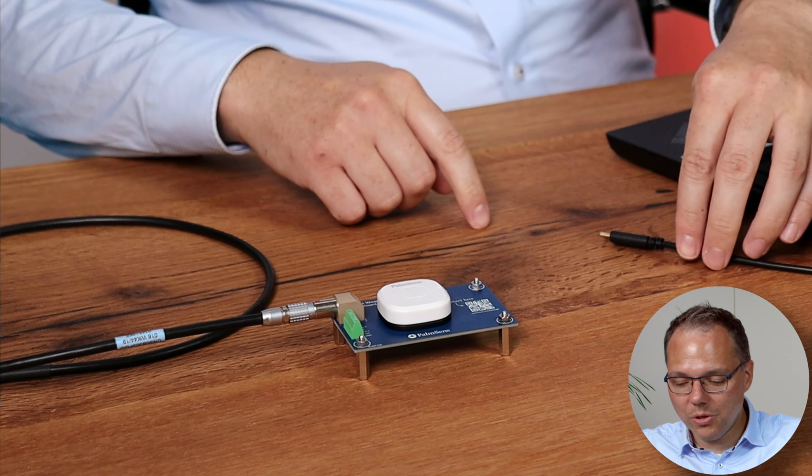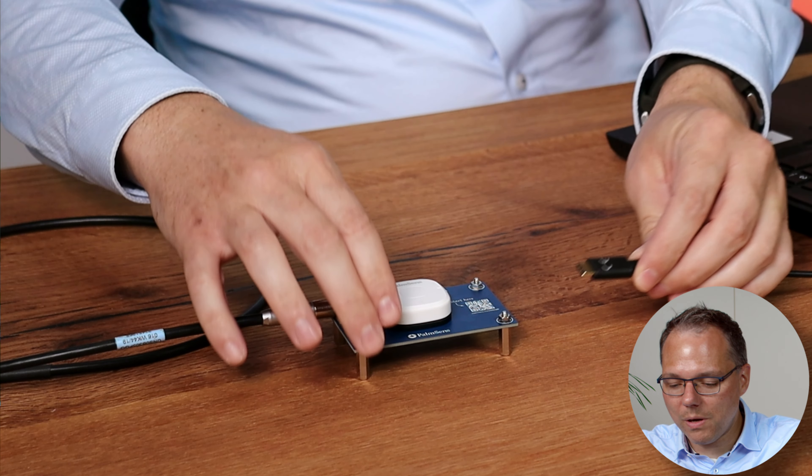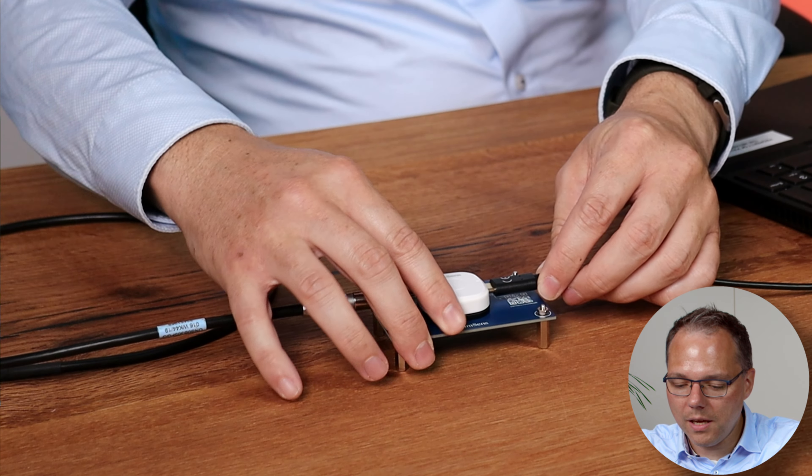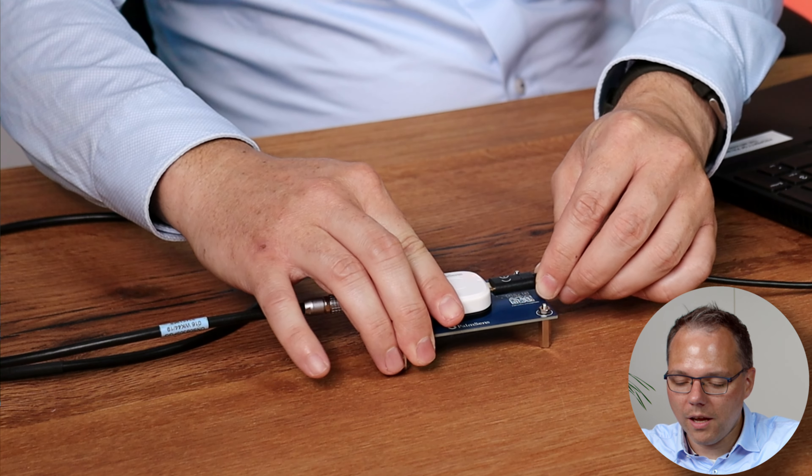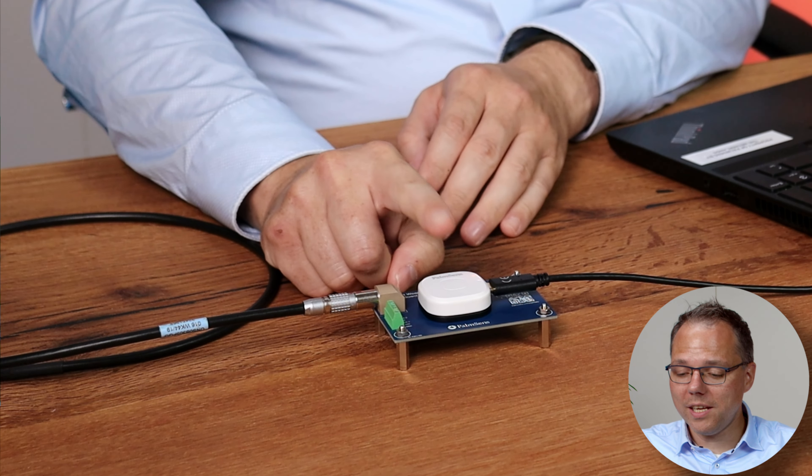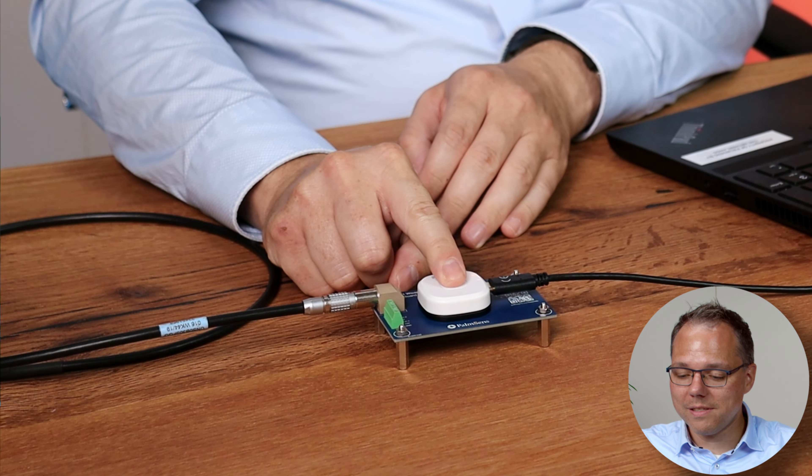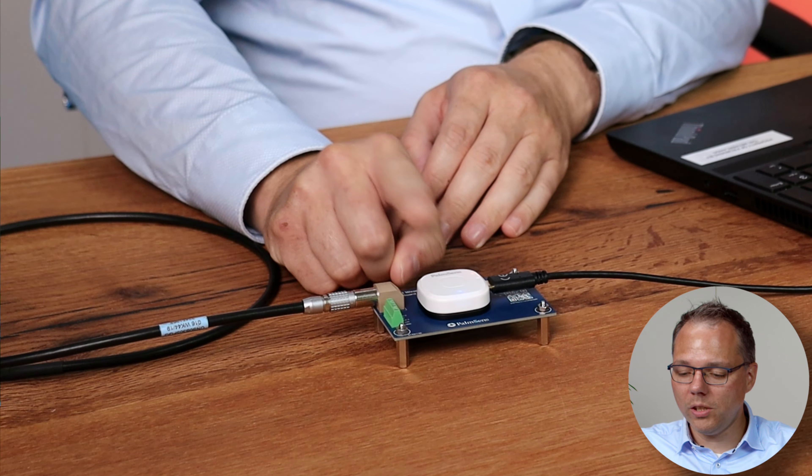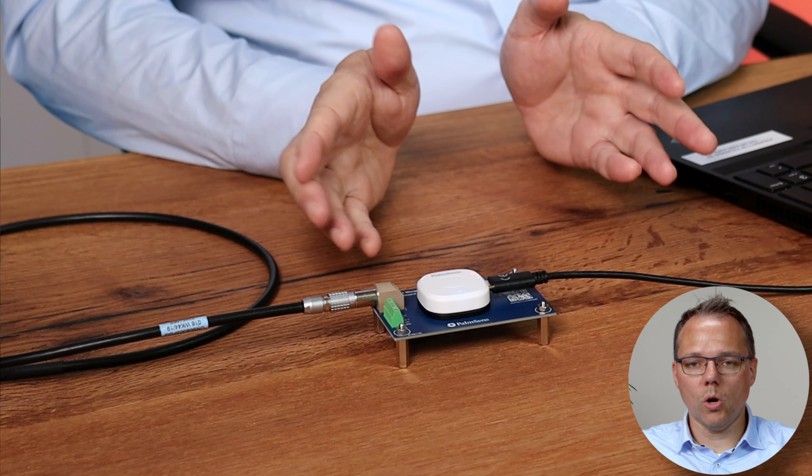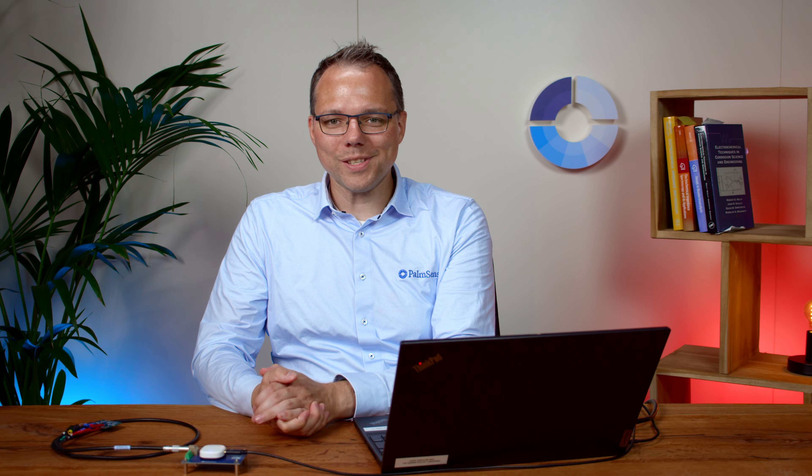Then to connect our Sensit wearable I have here a USB-C connector which is connected to my laptop. Then I switch my Sensit wearable on and I'm good to go to use PS Trace to put a script onto my Sensit wearable.